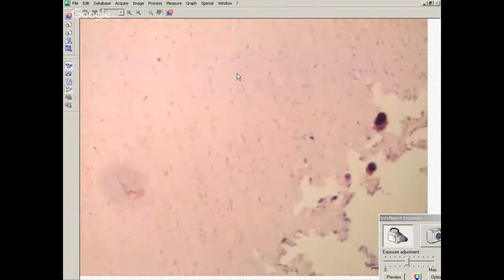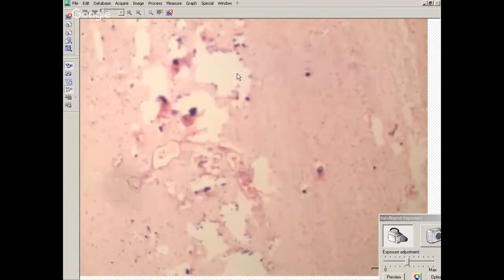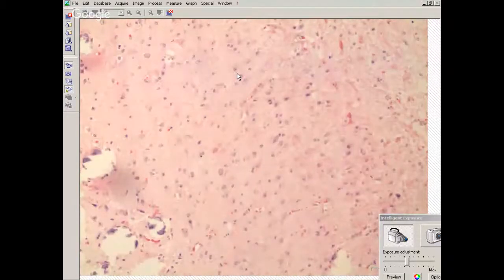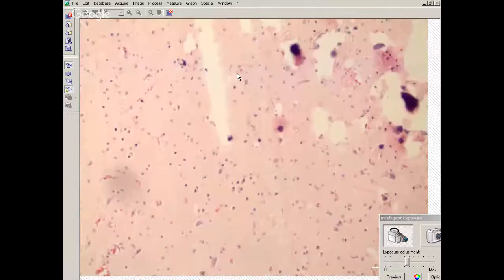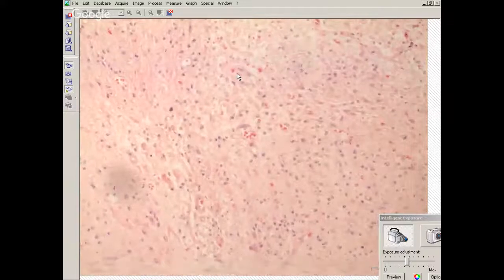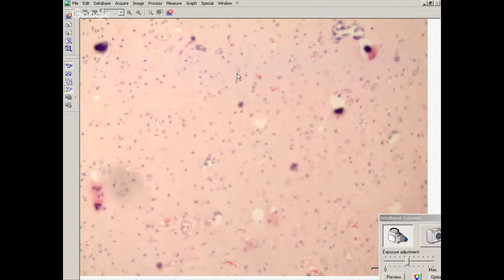and within the cortex, you'll also see tumor cells infiltrating into that cortex. I'm not sure if it's fragmented, so it's a little hard to demonstrate on this one. But typically you end up having neurons that are surrounded by tumor cells, and oligodendrogliomas typically love the white matter and cortex. They love cortex, they expand the cortex.